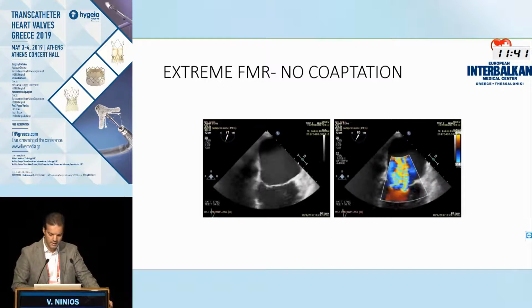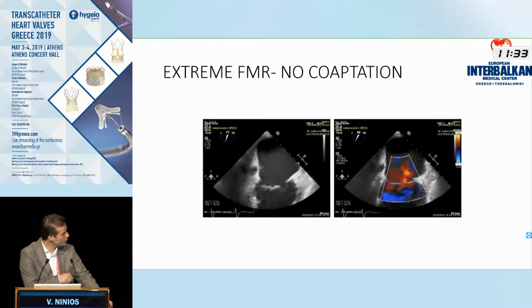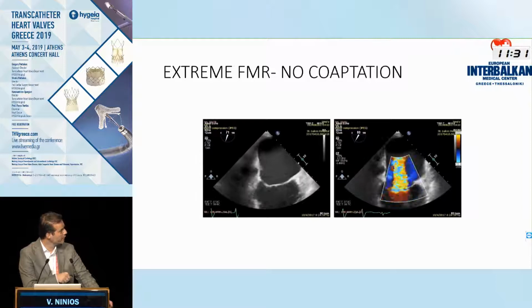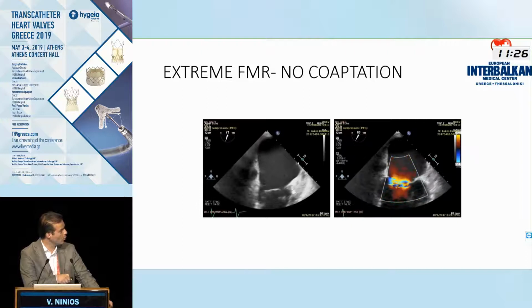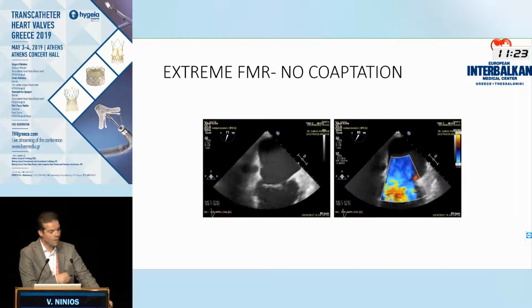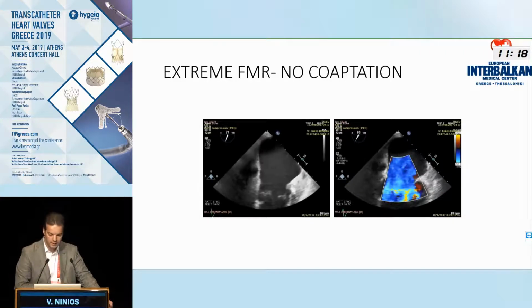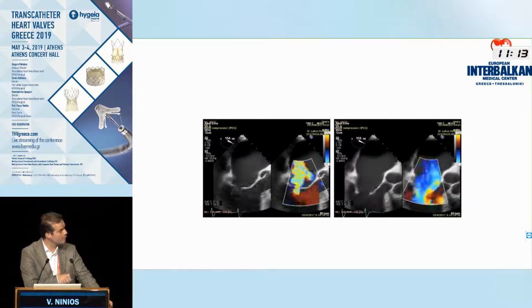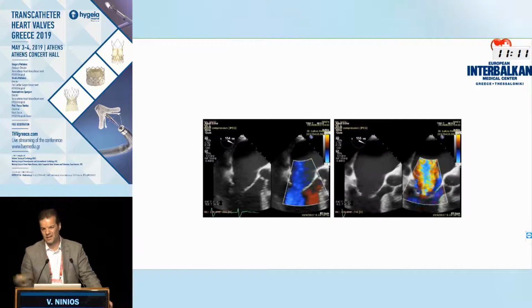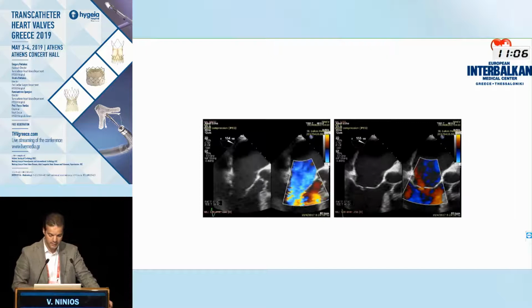And here is another case, which is even worse. Now, total remodeling of the mitral apparatus, dilated atrium, dilated annulus. The leaflets are horizontal. There's a horrible mitral regurgitation. This is a commissural view again. So this is not only 1, 2, 3 jets or one huge jet with a vena contracta over 1 centimeter on the commissural. This is the long axis. And practically you can see that the leaflets are not coapting. So you know up front that this cannot be fixed by one clip. Maybe 2 clips will not be enough. 3 clips may be necessary.